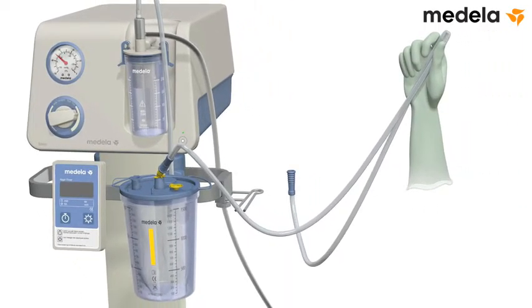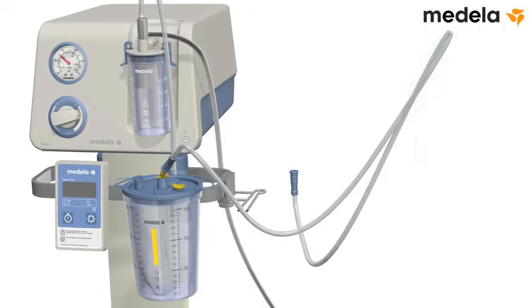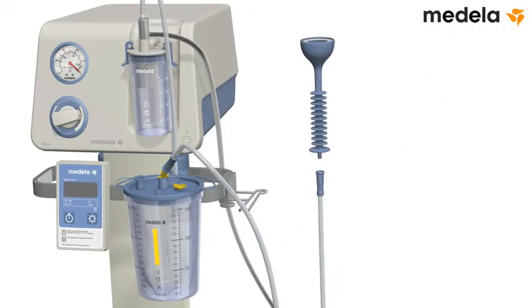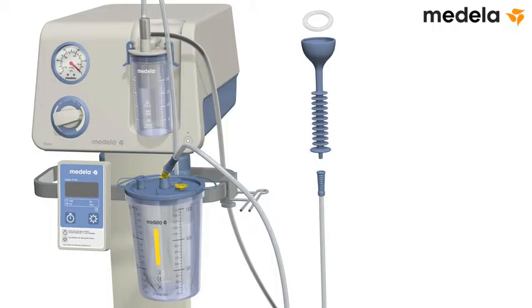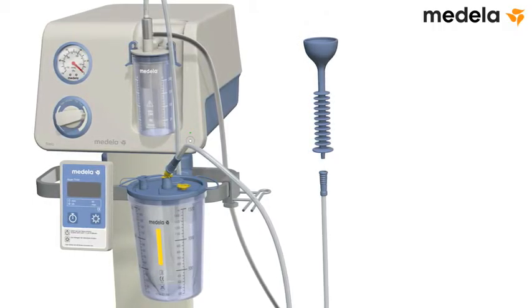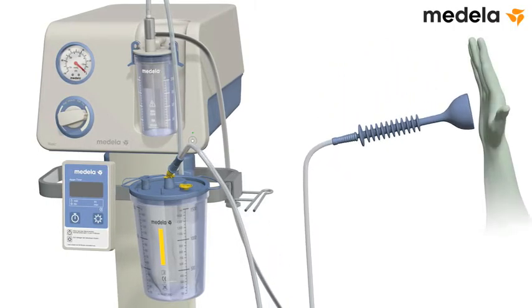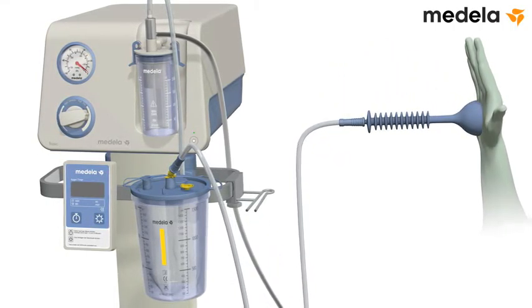When the vacuum gauge shows that the vacuum is stable at the set level, release the tubing. Remove the plastic disc from the sterile cup. Attach the tubing to the cup. Test the vacuum against your sterile gloved hand.